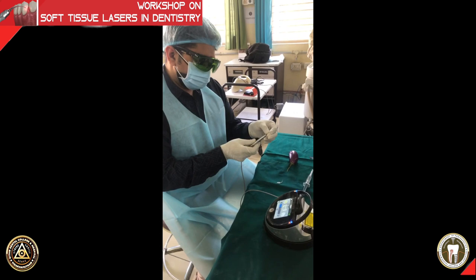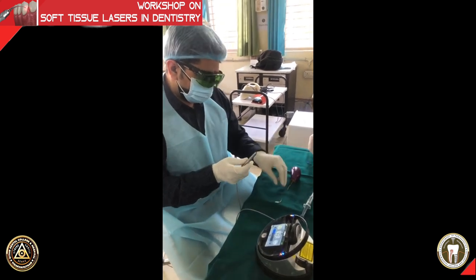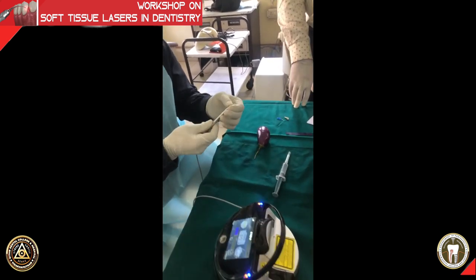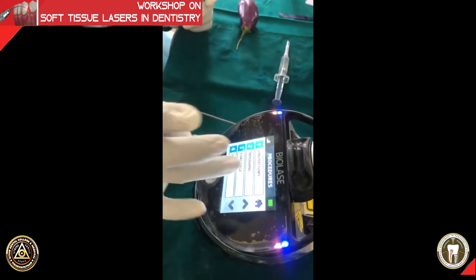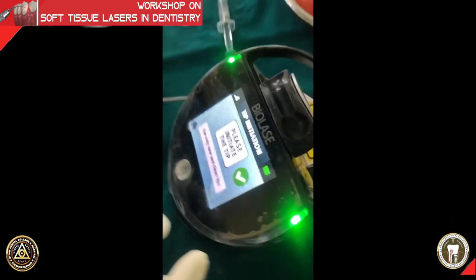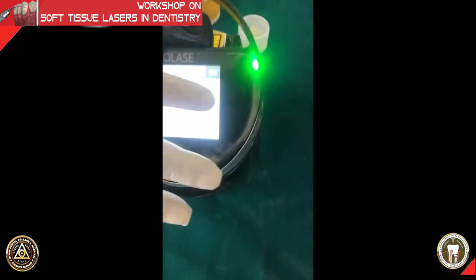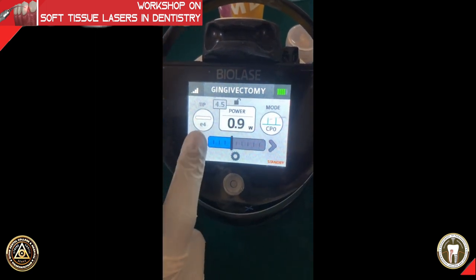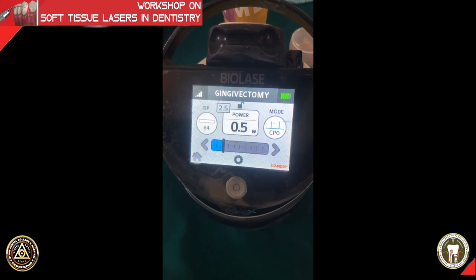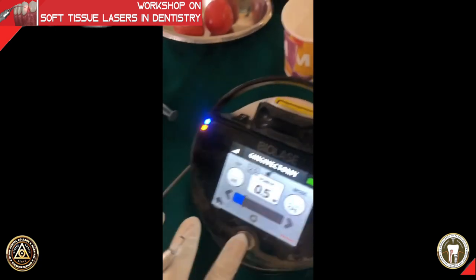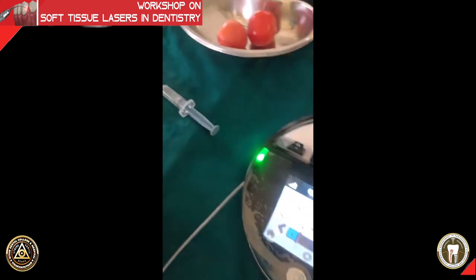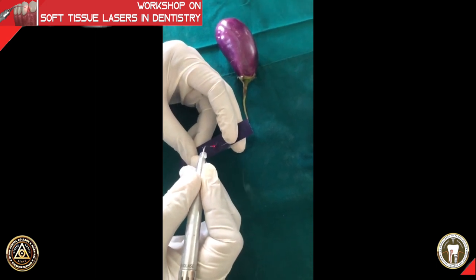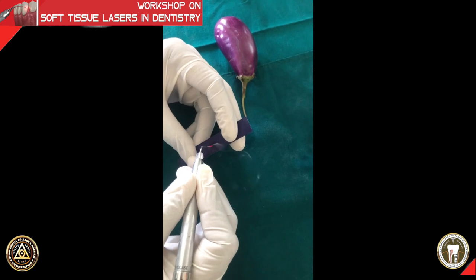We are going to put an E4 tip, which is a 400 micron tip, and this will be used for surgical procedures. The first step is always initiation, because you are performing a procedure in contact mode. With a non-initiated tip you can do non-contact mode procedures, for example PBM, without initiation. Here, however, you must initiate by placing the tip in direct contact with the articulating paper, which results in a flashing.